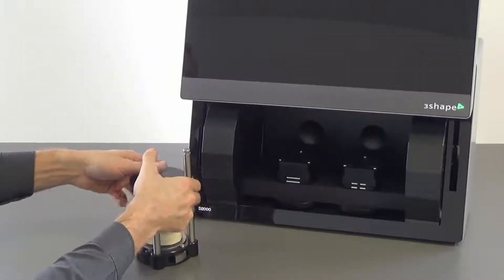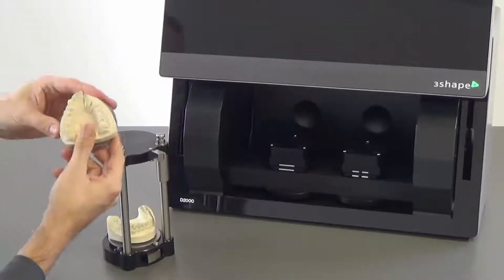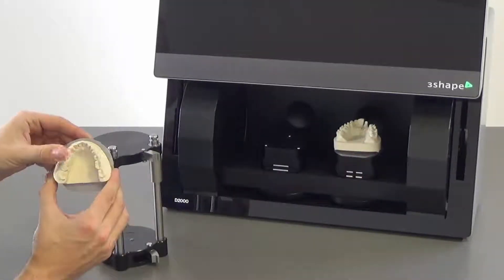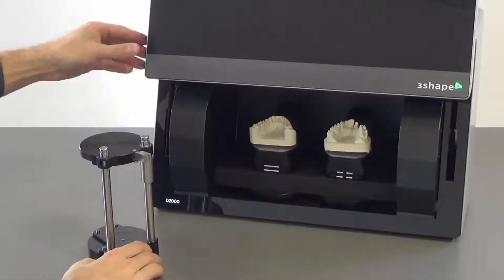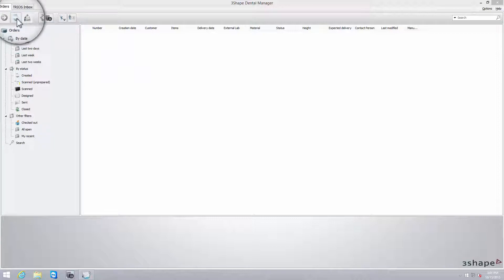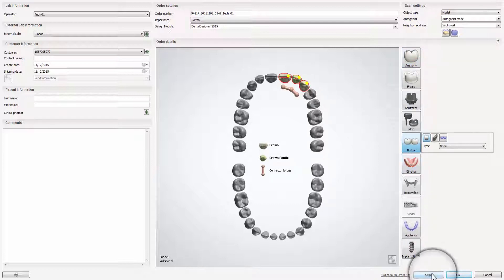Once the correct occlusion has been set, open the locking mechanism and remove the models along with the interface plates from the Occlusion Setup Tool. Then insert the plates along with the models into the scanner. The upper model should be inserted on the right and the lower model on the left. Now you can open a new order form, create the requested order, and click Scan.